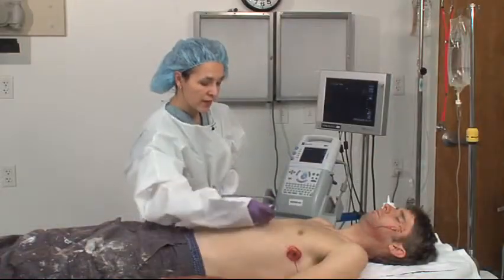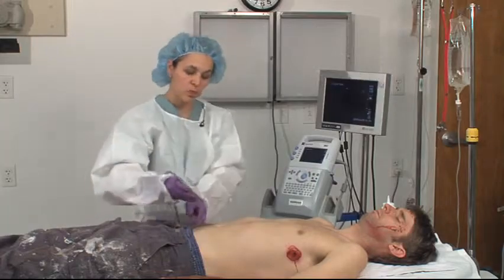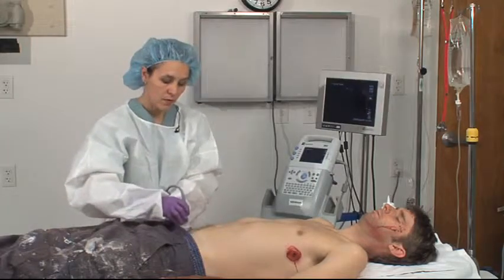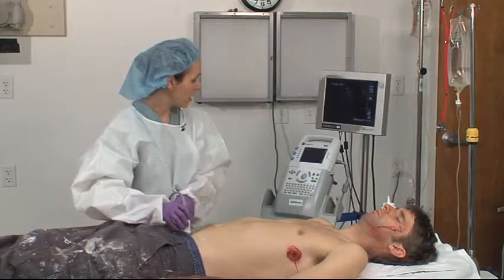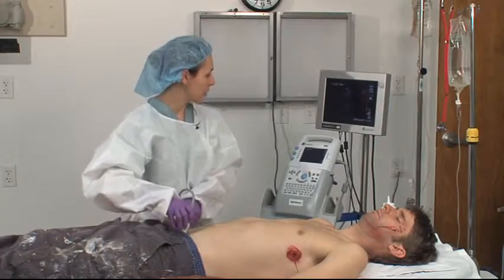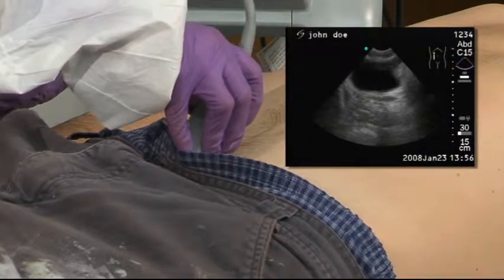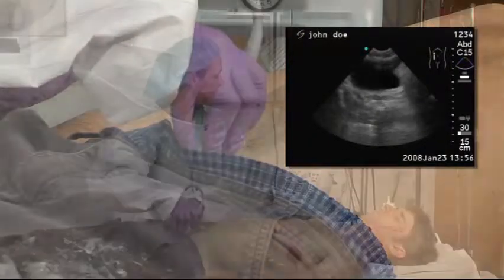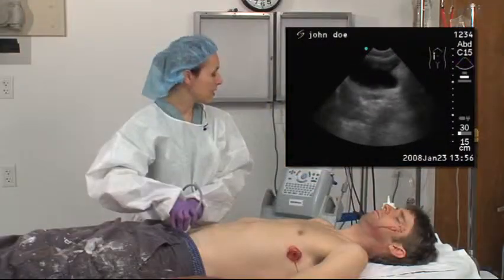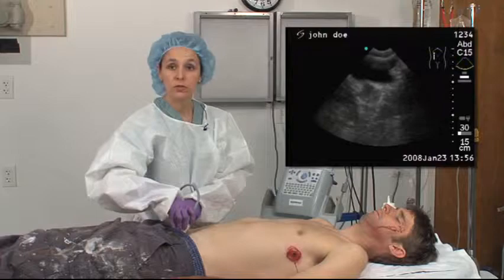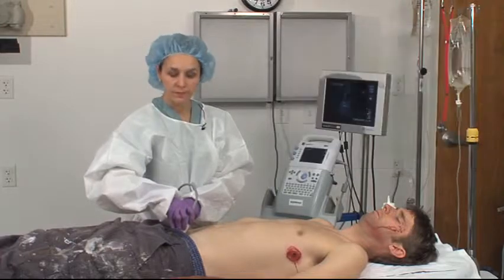And finally, the supra-pubic window, right above the pubic prominence, to find the bladder, looking in the pouch behind the bladder to exclude blood as well.